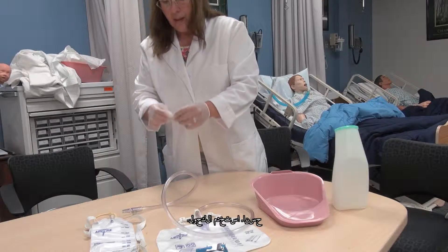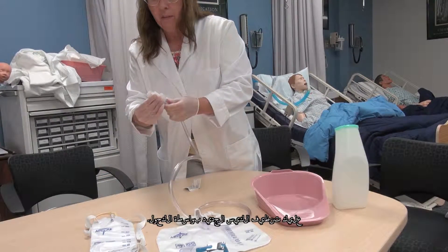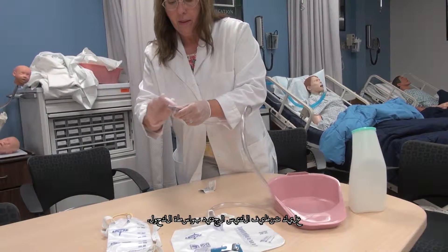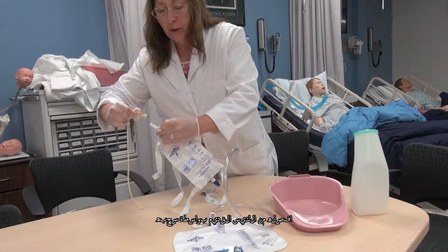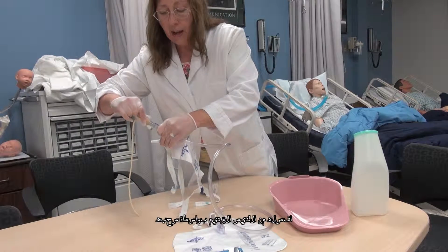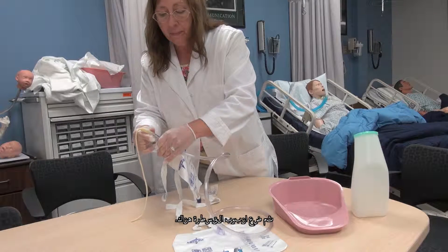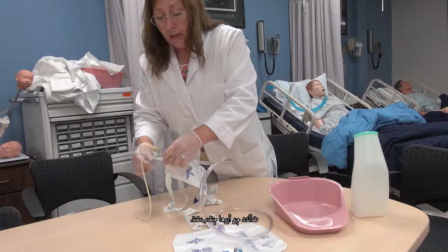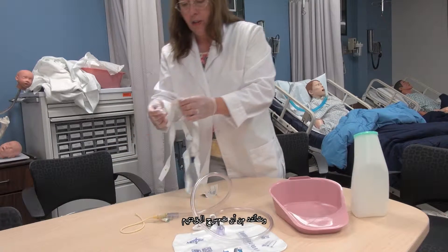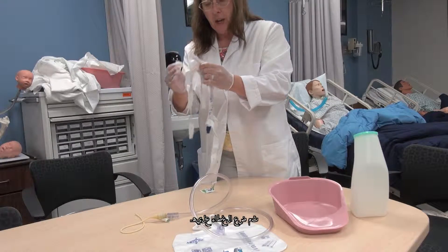Use alcohol. You want to clean the new bag with the alcohol, separate from the old bag by pulling it off, and then you just place that catheter onto there. Make sure it's secure, and make sure that you wipe off the old one and put the cover on.